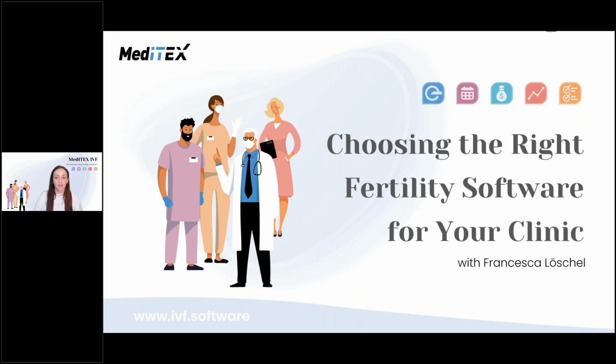So today I would like to introduce to you MedITEX IVF, the world-leading fertility software used by clinics across the globe. To make sure that we are all on the same page, I would like to share the agenda real quick with you. I would like to start by introducing myself. I'm going to give you some key information about the company behind MedITEX, and then I'm going to show you the key functionalities of MedITEX IVF. And in the end, you can ask questions in the Q&A box, but I am going to remind you more often throughout this session.